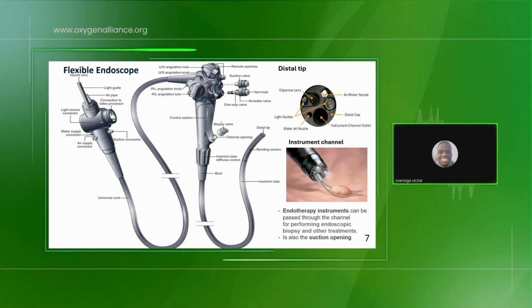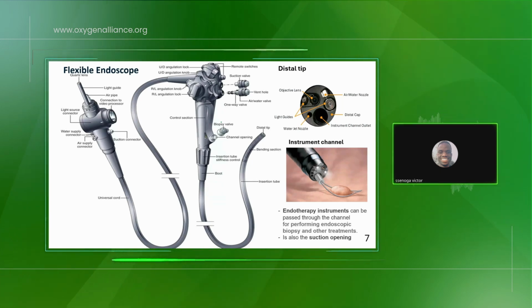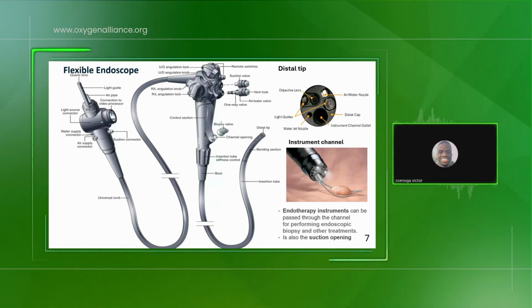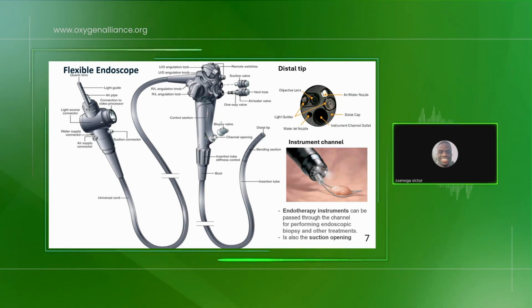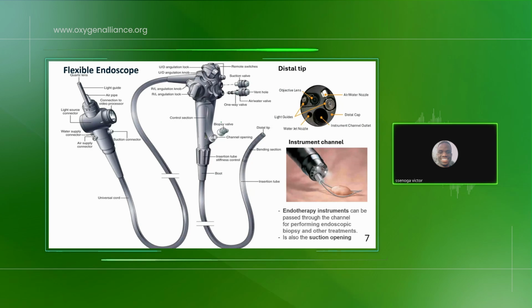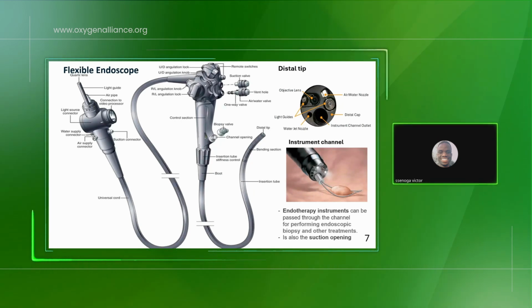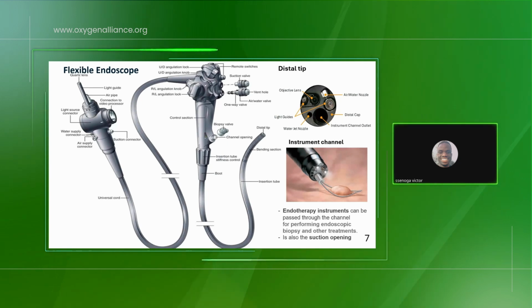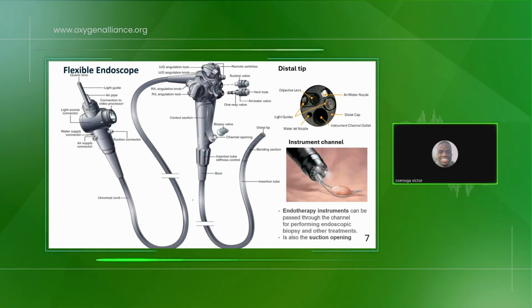I have an issue with an Olympus endoscope, a gastroscope specifically, and it doesn't do air insufflation. That's the only issue it has at the moment. I don't know what the issue could be there, because it does water insufflation, but it doesn't do air insufflation.